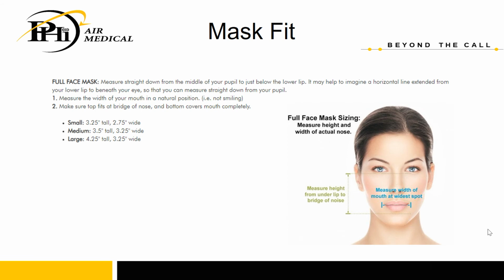A quick word about mask fit. We tend to pick the incorrect size mask for our patients. We tend to go a size too big for most of our patients, just because we are used to looking at a 5'10", 200-pound male and saying, well, he wears a large t-shirt, so he probably wears a large BiPAP mask. And that's simply not the case.